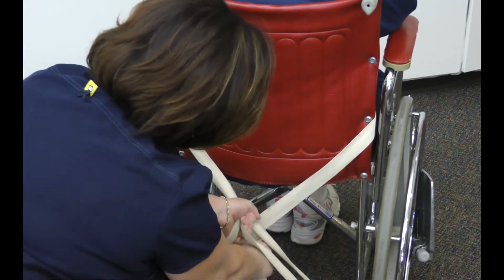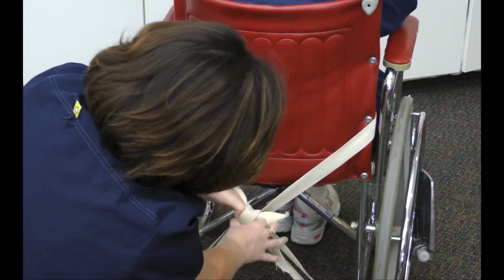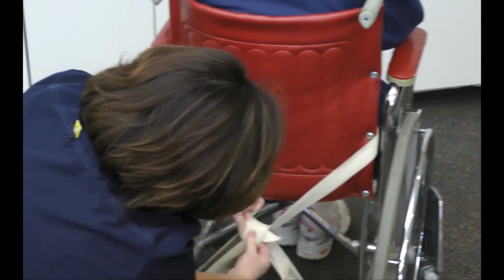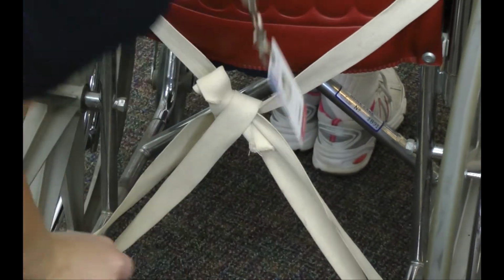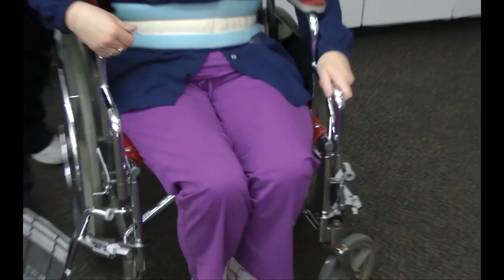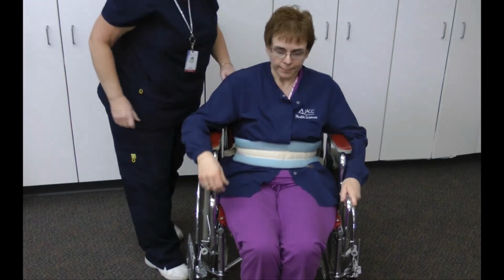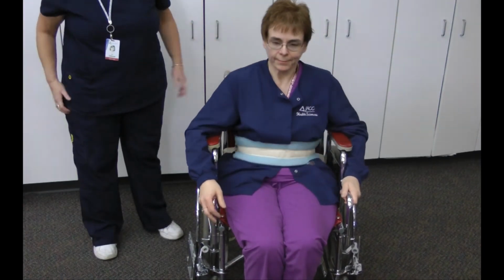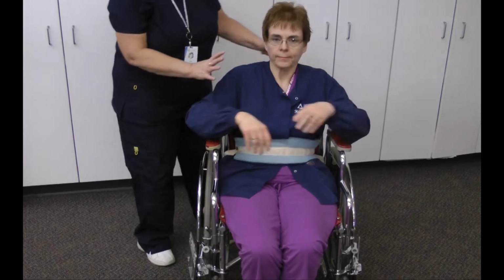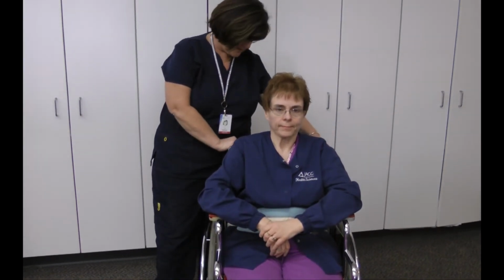You're gonna have to practice with this a little bit, but a slip knot is something that can be pulled with one finger. Okay, and that's how the restraint needs to go. I want Melissa to turn back around so you can see how it fits right on her waist here. Okay, Melissa, can you lean forward a little bit? Yep. And that's what it's to do. It's safe, it's comfortable, but it keeps Melissa in her chair should she need to be restrained for her self-protection. That's why we put on restraints.